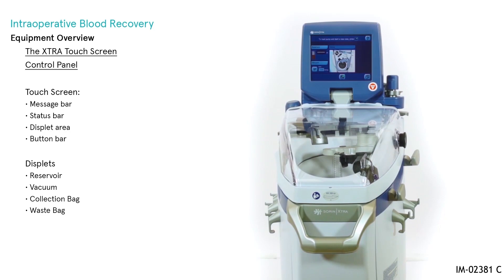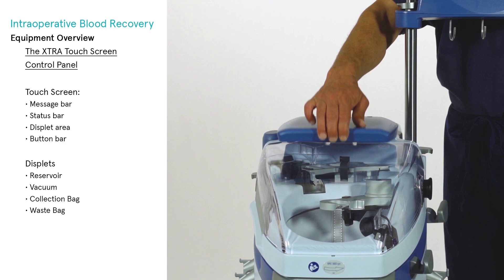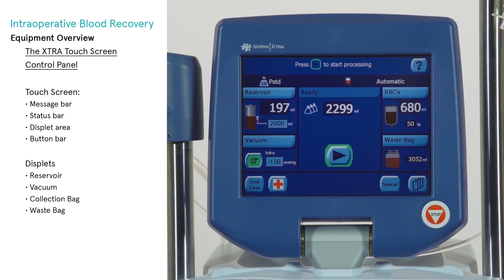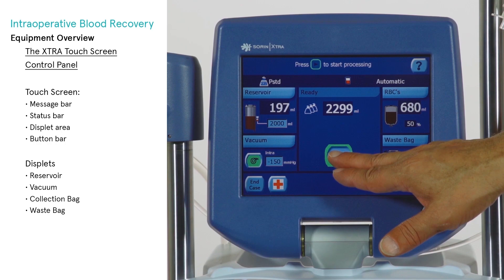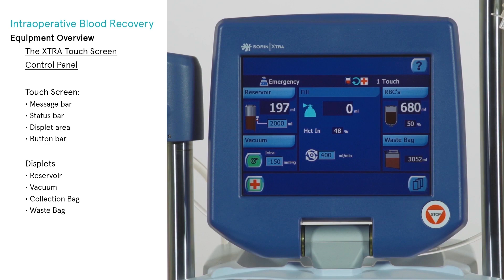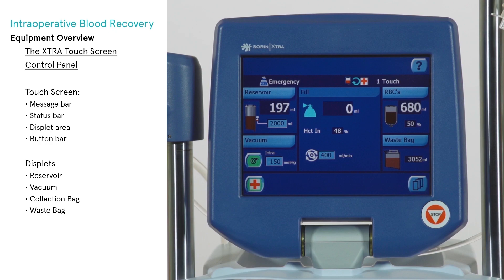The Extra control panel is mounted centrally on a hinge that allows the screen to be rotated and tilted. The operator interacts with the touch screen display through various screens by touching the screen where indicated by buttons and tabs. The touch screen is segmented into four areas: message bar, status bar, display area, and button bar. Any light blue area is a touch interface — an action will occur by touching anywhere within the light blue area.